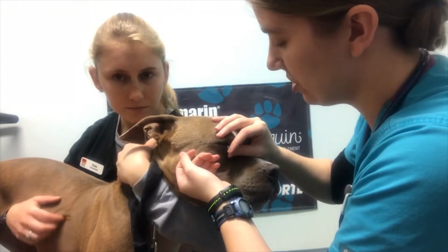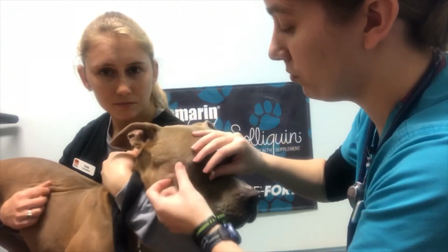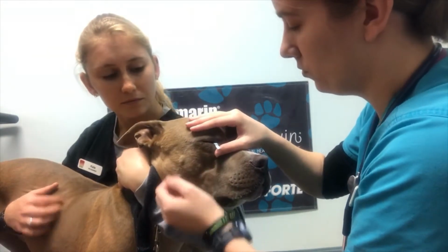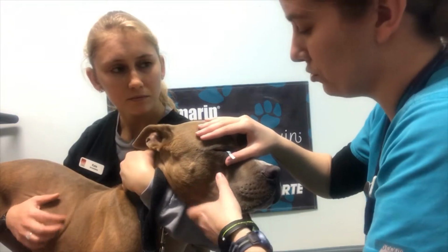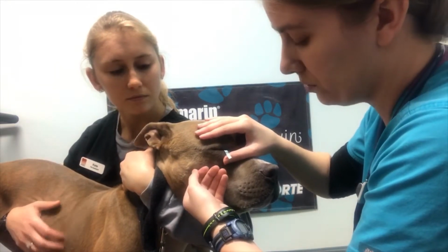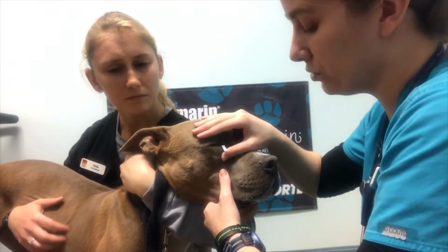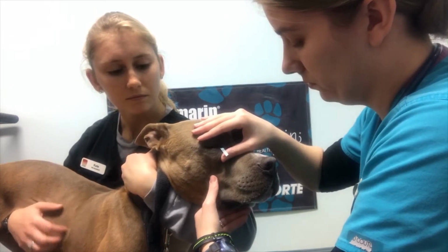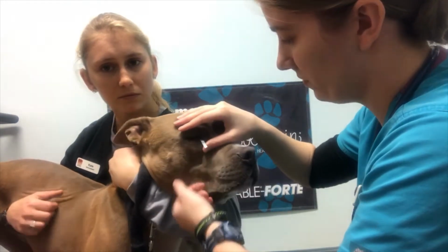This is a good test to check for if you're worried and suspect dry eye. Already he's passed the normal amount, which greater than 15 is considered normal. He already passed that, but it's still always good to hold it for the full 60 seconds so you can get an accurate result. We're almost there, bud. Almost there. Hang on, bud.